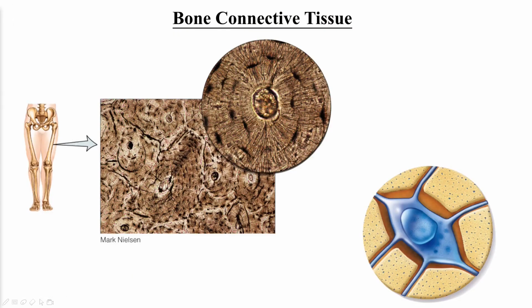The last tissue for this lab is going to be compact bone tissue. It also goes by the name osseous tissue. It consists of a calcified matrix arranged in concentric lamellae around central canals. The central canal is the hole in the middle where blood vessels would be located inside a live bone. The concentric lamellae are like layers of an onion. Together, the lamellae and the central canal are called an osteon.